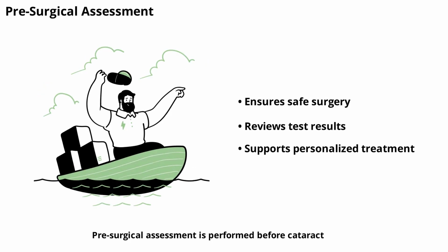Pre-surgical assessment is performed before cataract surgery to ensure safe and effective outcomes. The doctor reviews test results, evaluates eye health, and discusses surgical options. Pre-surgical assessment includes imaging, biometry, and other specialized tests. Thorough evaluation supports personalized treatment and minimizes risks.